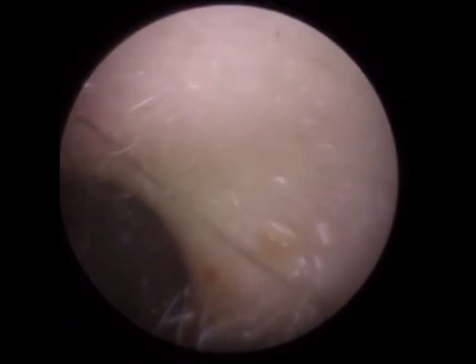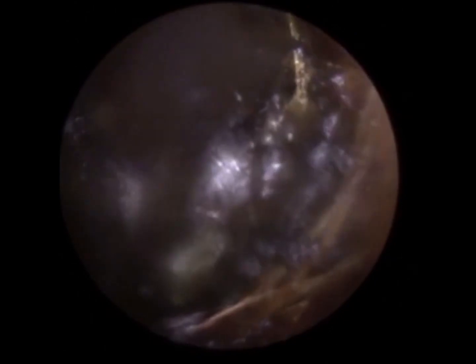Another way I can describe this particular case, if you've got a little tub and you get some margarine or butter and you put it into this little bottle or container, and you really compress it with a spoon, a teaspoon at the top. So that bottle, that little container, is the patient's ear, and the contents, that butter, margarine consistency type of wax, that's what we need to get out of that bottle or jar. But we've got to do it obviously in someone's ear.